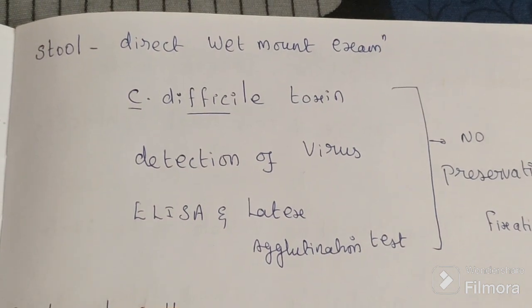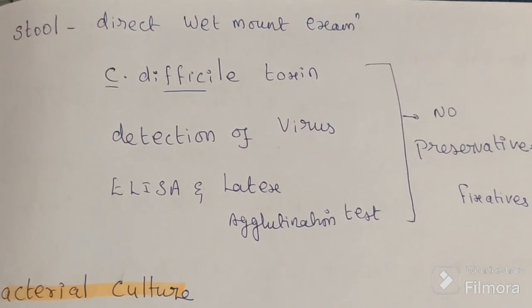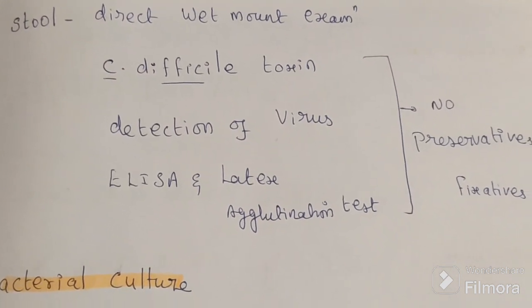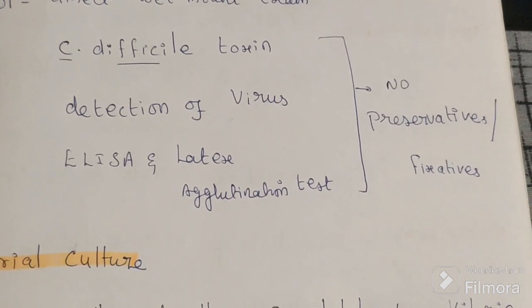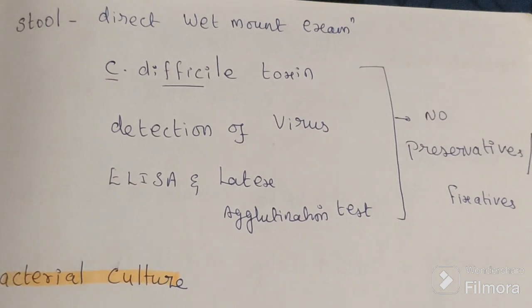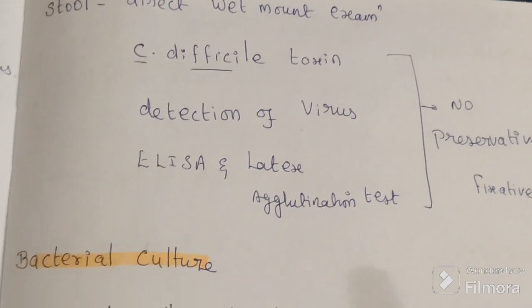In the case of direct wet mount examination, Clostridium difficile toxin, detection of viruses, ELISA technique and latex agglutination, there is no need for preservatives or fixative. Freshly collected stool only is recommended for this kind of test.